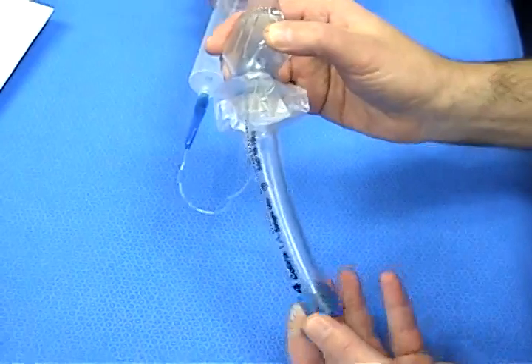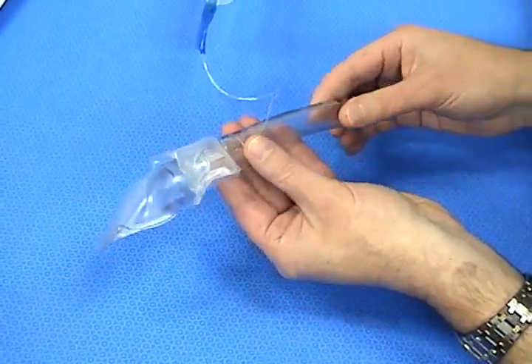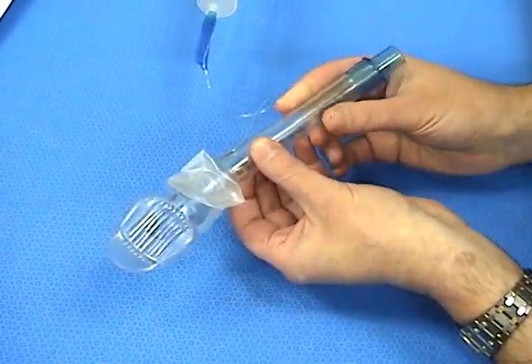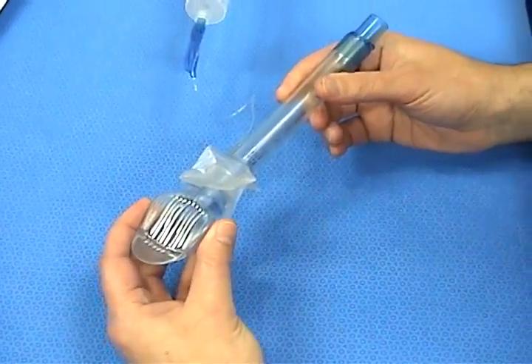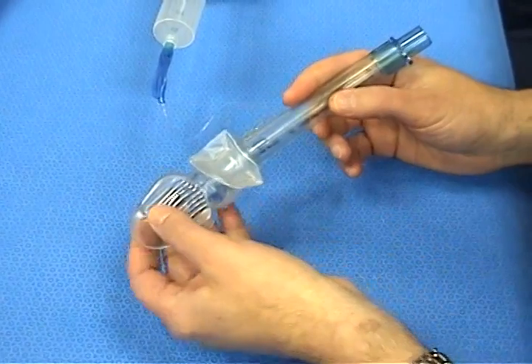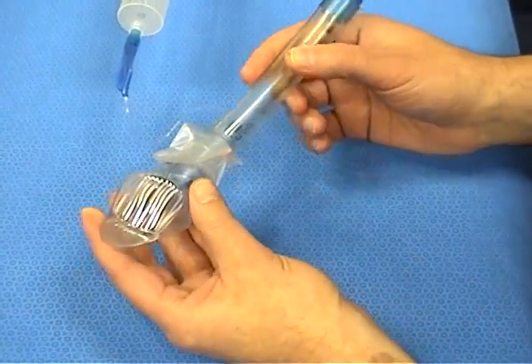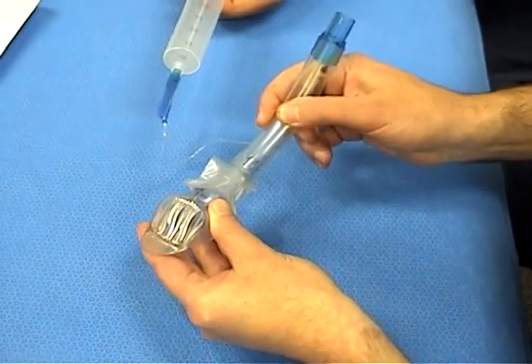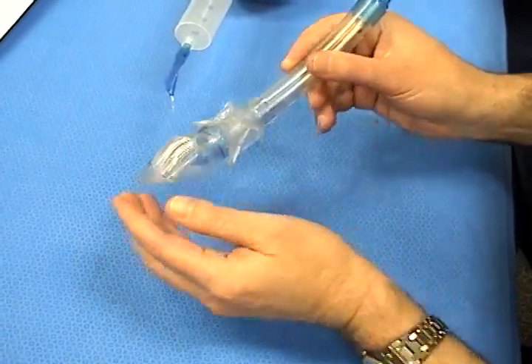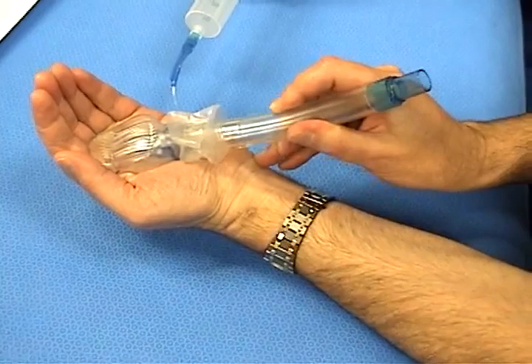The tube of the Cobra PLA is wider and shorter than other supraglottic airways. This provides less resistance to flow and allows easy passage of a video scope. The Cobra head is wide and it centers the device in the airway, pushing tissues out of the way. The epiglottis will typically be above the grill with the vocal cords opposing the grill. The grill keeps the epiglottis from clogging the distal end of the tube. The tube is soft enough to bend, but stiff enough not to flip over. The Cobra head is shorter and smaller than other supraglottic airways. It is inserted very much the way a laryngeal mask airway is, popping behind the tongue.